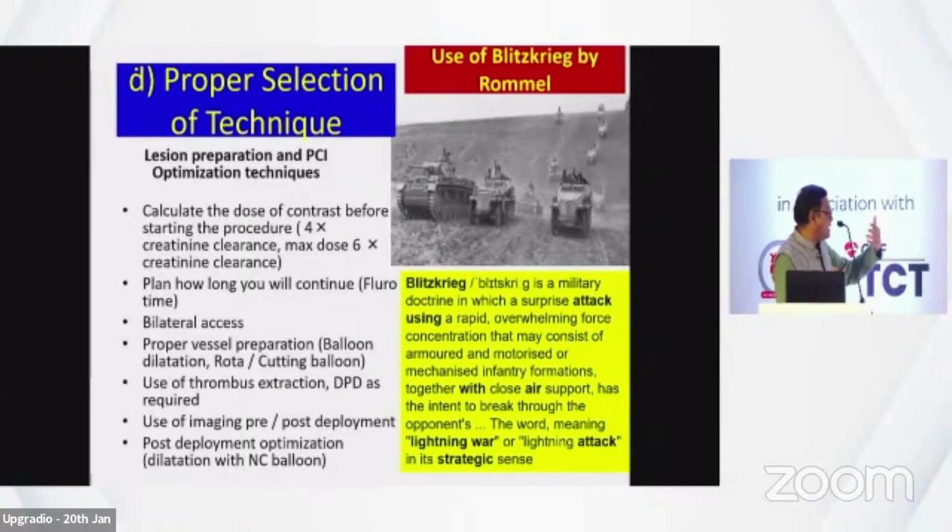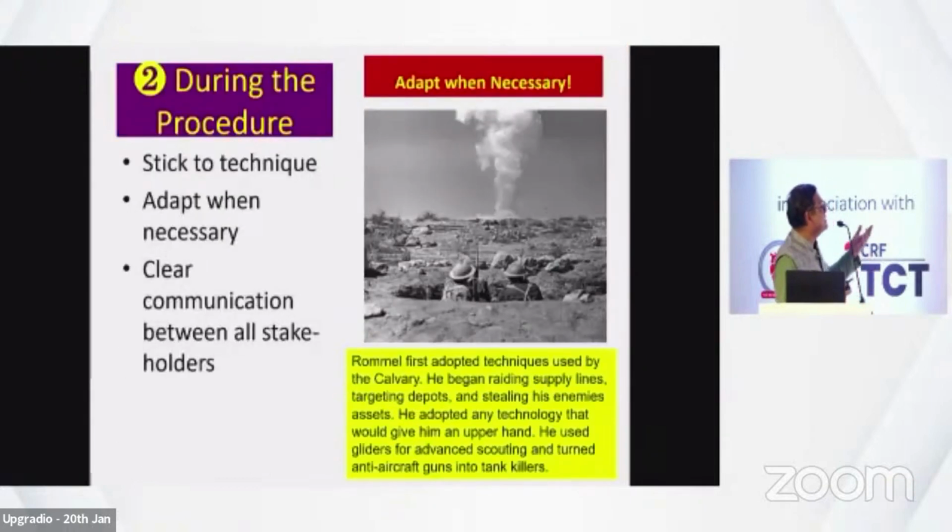Also, I already discussed proper vessel selection, proper vessel preparation, whether by balloon dilatation, rota or cutting balloon, whatever it is. Then thrombus extraction where necessary, imaging where required. So these are, I think, the common things that you need to do.